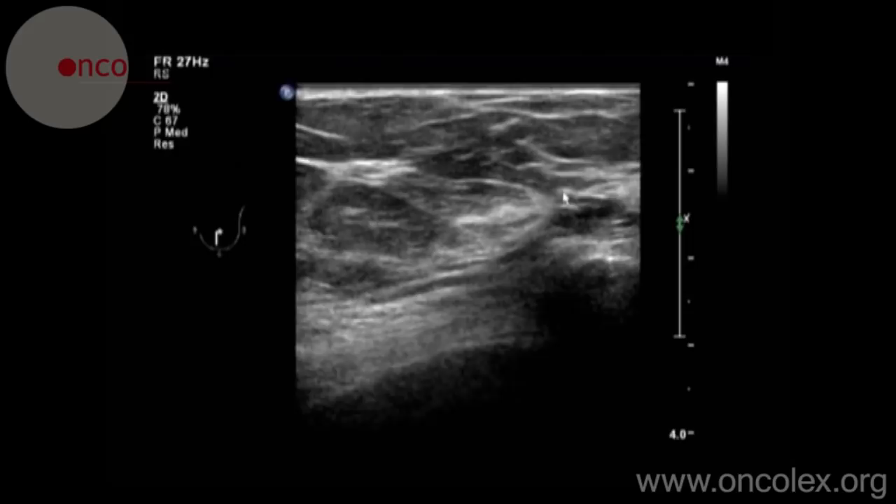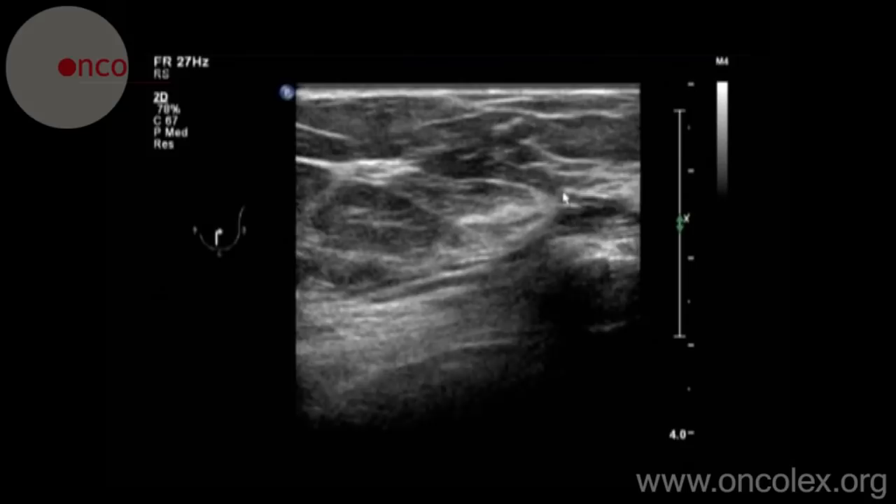The aspiration is monitored using ultrasound. This is the needle in movement.